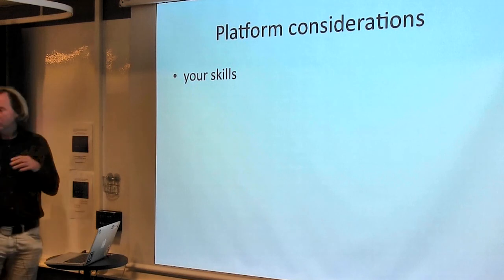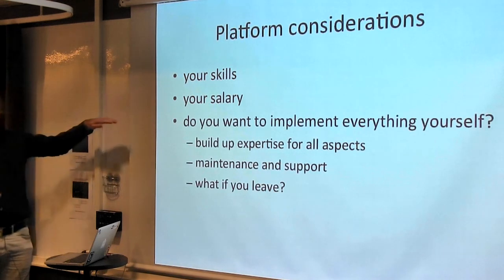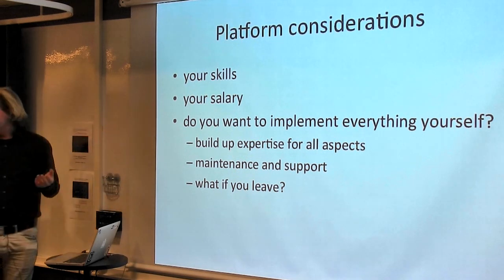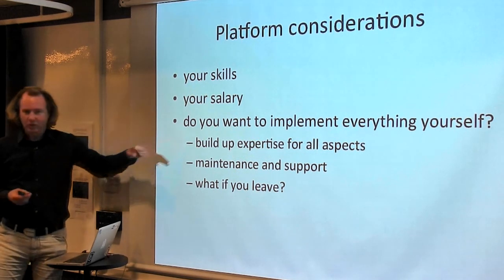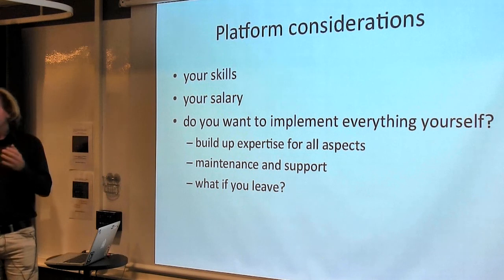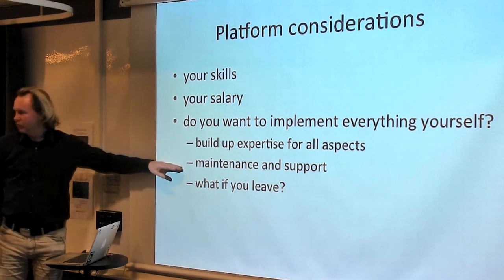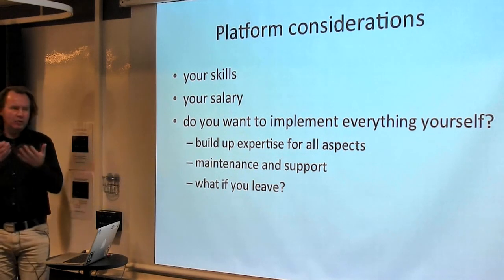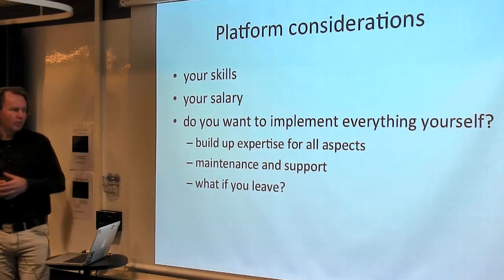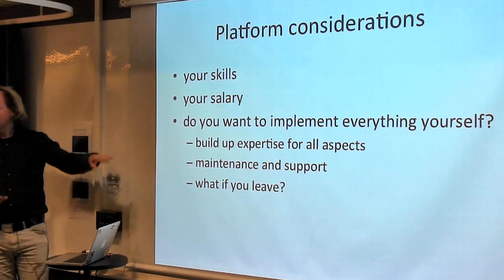What you have to consider in choosing your platform for doing real-time experiments is mainly your own skills and your own salary. And do you really want to implement everything yourself? Of course, that's interesting. It means that you will build up expertise for all the aspects, and especially for people with an engineering background, these are very interesting projects to work on. But if you take a slightly more macroscopic view, you also have to consider maintenance and support. If you build a system and your lab starts depending on it, then you are also responsible for maintaining the system and making sure that new people can start using it. And what if you leave? Will the system still be used? So long-term investments are also important.